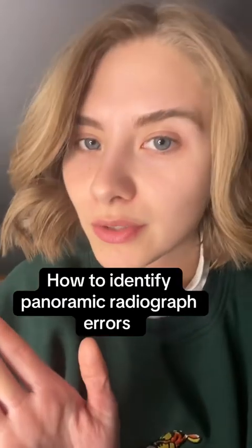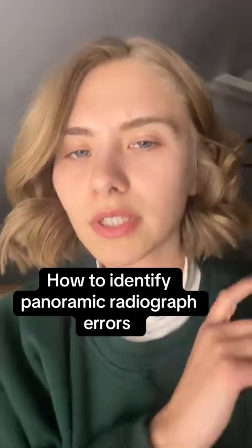I'm a dental hygiene student. I was not a dental assistant before. Let's talk about x-ray errors, specifically in the panoramic.